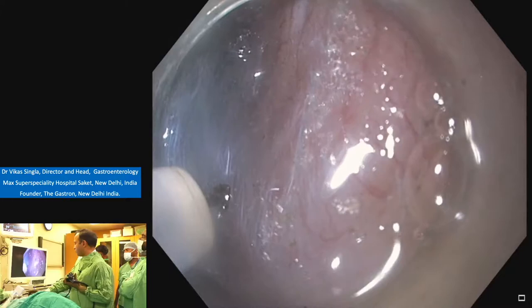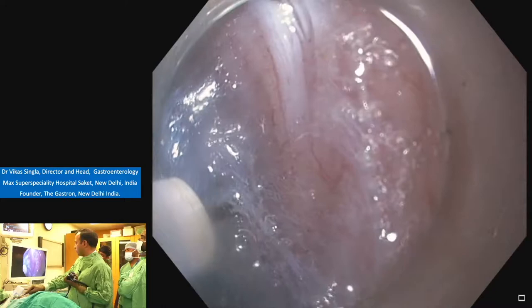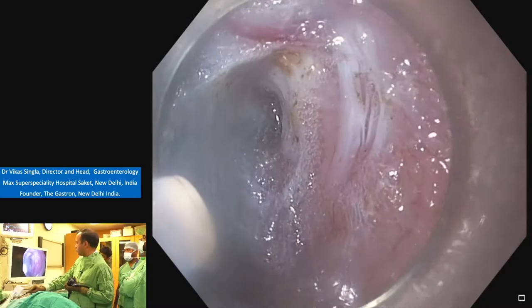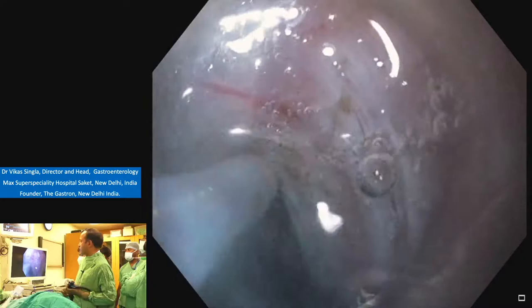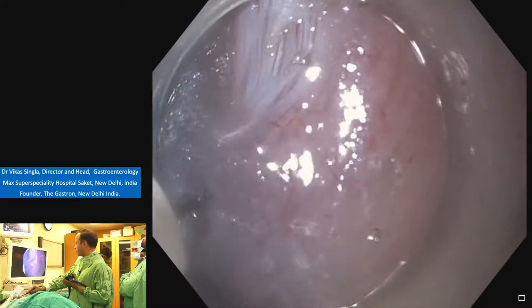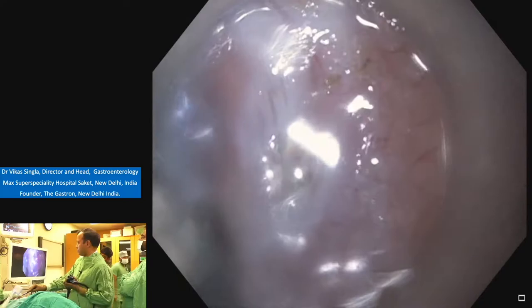So we are moving with the shaft and up and down knobs. We are not using or minimally using the left and right knob. Mainly it's the shaft and the up and down knob. Now it's getting narrowed, so we have to inject more fluid. So whenever there is narrowing in the tunnel, we have to inject more fluid and dissect on the side. You can see that we are dissecting on the side. Then moving towards the other side.